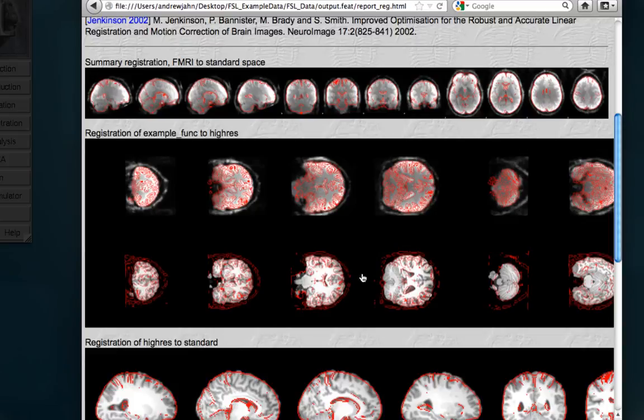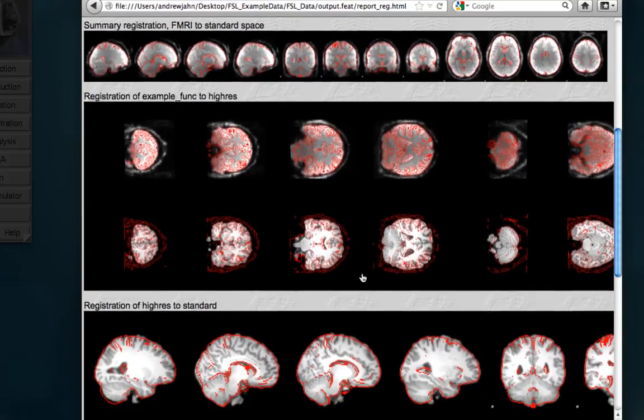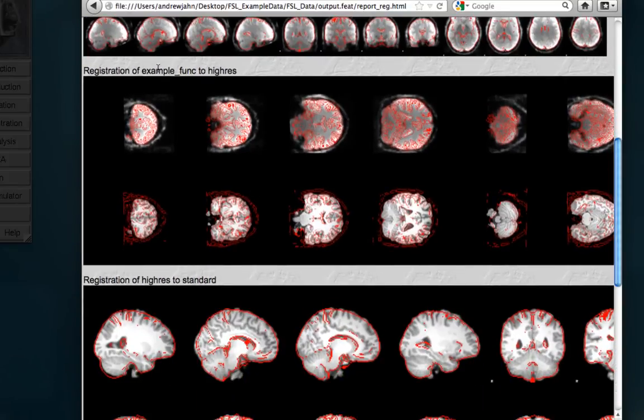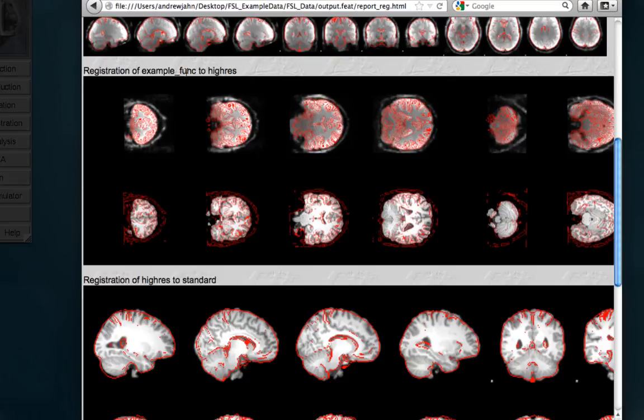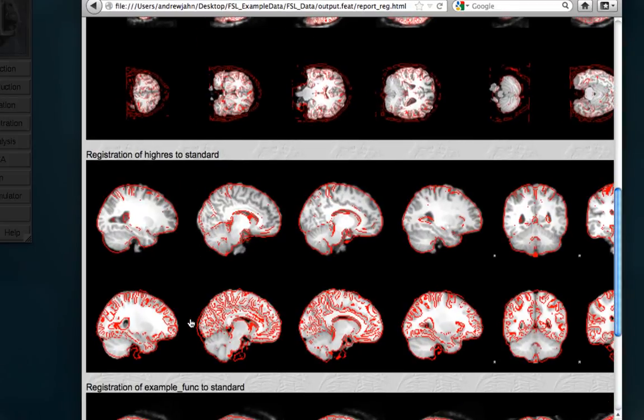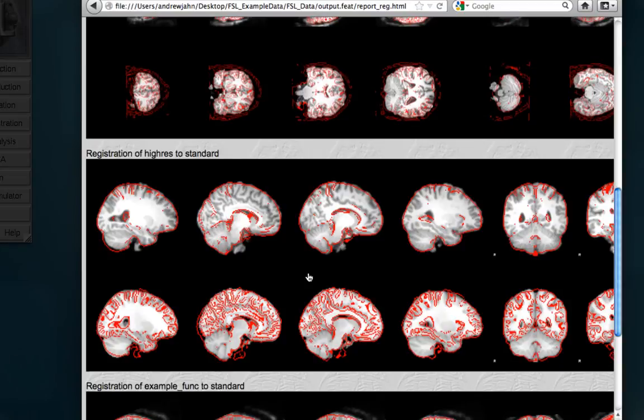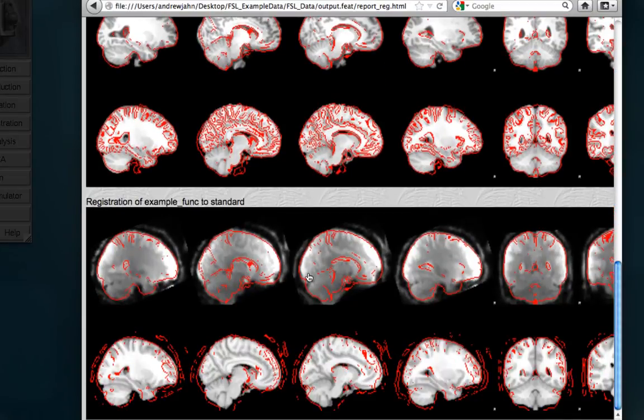So, ventricles, in this case, are a very good proxy for estimating how good of a job it did in aligning the internal parts of the brain, which is usually what's of most interest. So, first of all, this is example func. So, our functional images to our high-resolution skull-stripped anatomical. The registration of our anatomical to a standardized space. Again, this looks pretty good. Nothing looks too out of order.